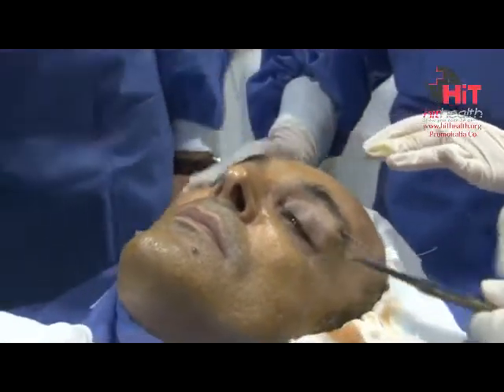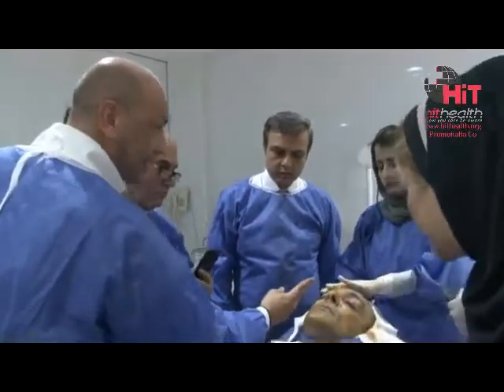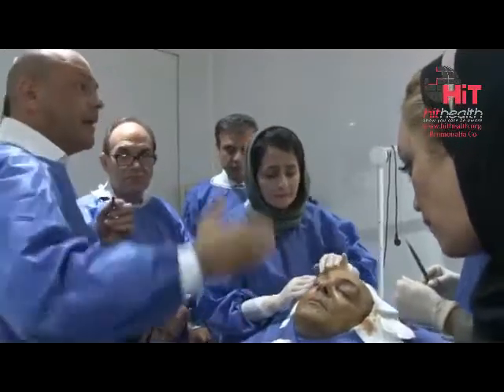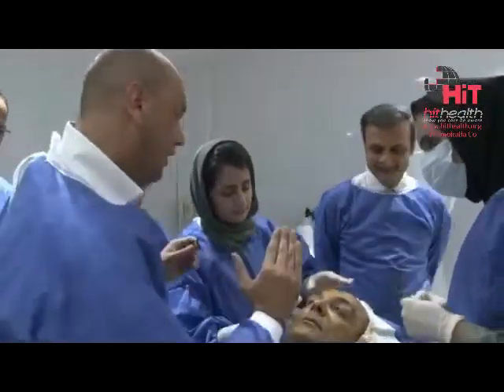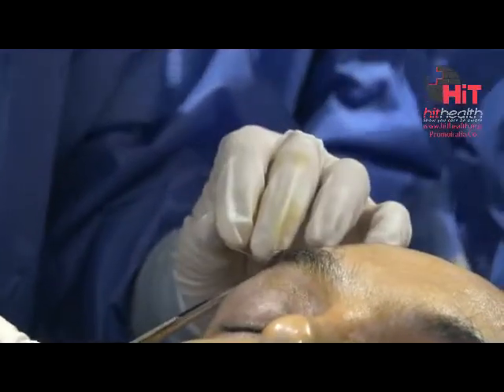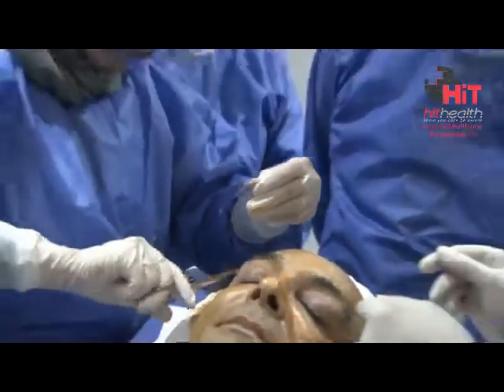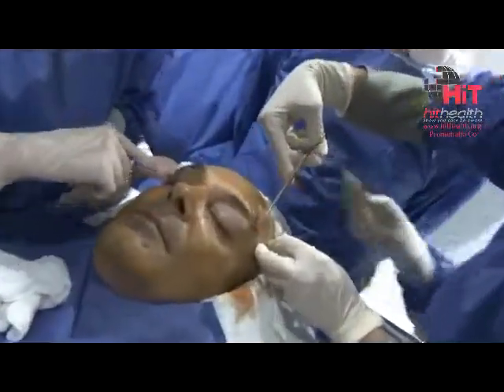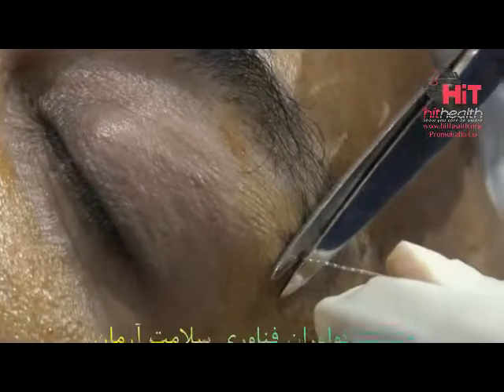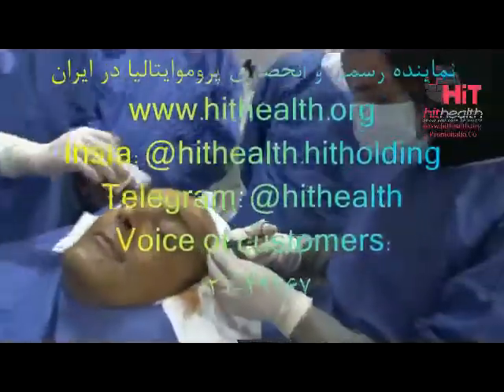Now, the procedure — you have two possibilities: either you cut all threads and finish, or you cut only part of the threads and cover the other part with the string. After one week, five days, Salvatore comes back to the office. You study — if you want, you can improve. Traction and cut. Immediately after, I usually — without gloves — I touch this area to be sure I don't feel the point of the threads.